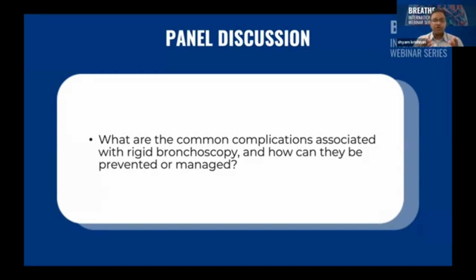If you don't do it, what happens is the camera slips in front of the scope. You have this illusion that you're already into the trachea, but in actuality, it's just the camera which is gone and the scope barrel remains outside. And that can sometimes, when you force the barrel in, damage the vocal cords. So the camera should always be behind the barrel. You should see the whole circumference of the barrel from the camera, the view you get.